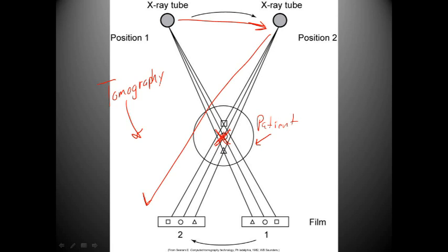If you can carry out these protocols, then technically each person that walks into the CT suite to perform a scan on a patient should be able to yield the exact same results, simply because of established protocols and a lack of variance in the ability to perform exams.